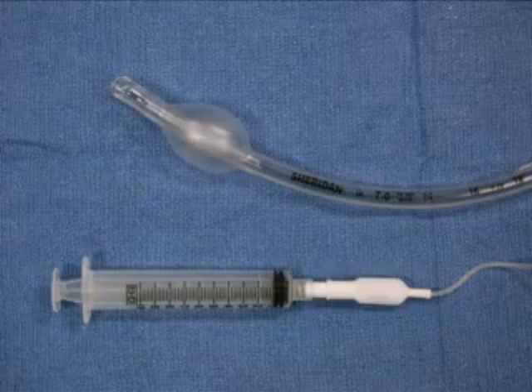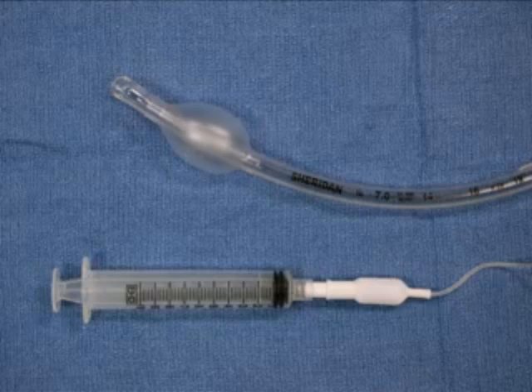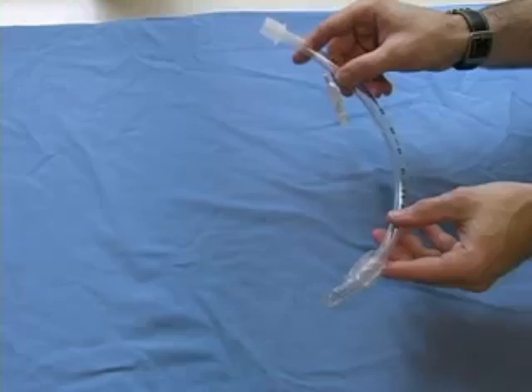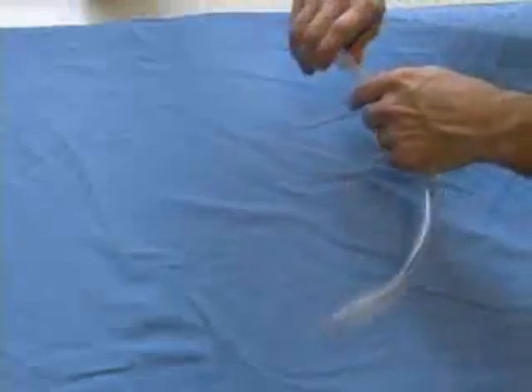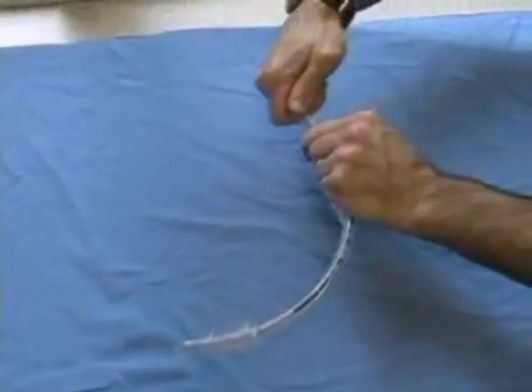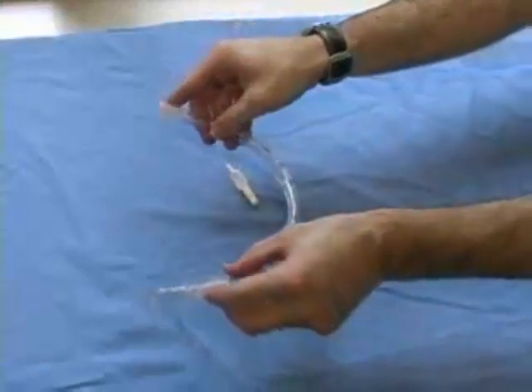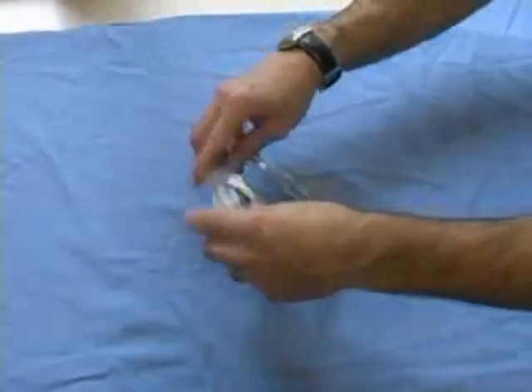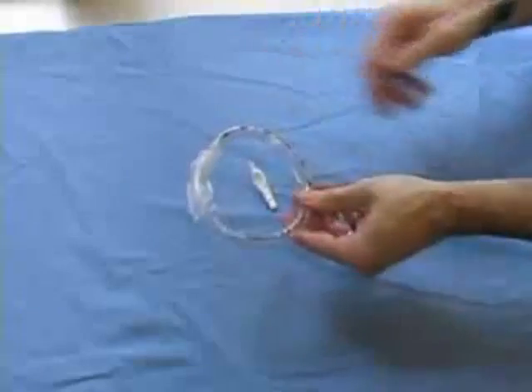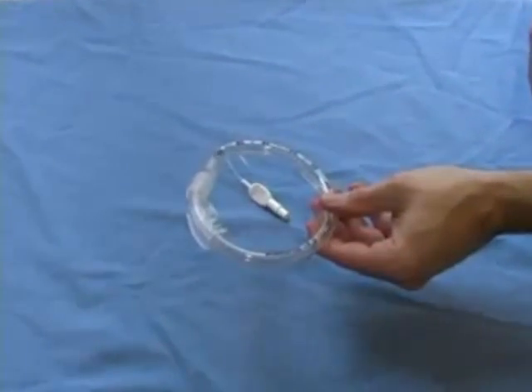Test the cuff on the endotracheal tube by inflating it with 10 milliliters of air using a syringe. If no leaks or defects are detected, deflate the air completely. To prepare your endotracheal tube for intubation, secure the connector in place. If you do not plan to use a stylet, you can bend the tube in the form of a circle. Although curving the tube is not mandatory, some practitioners recommend this step because it can facilitate tube placement through the vocal cords.